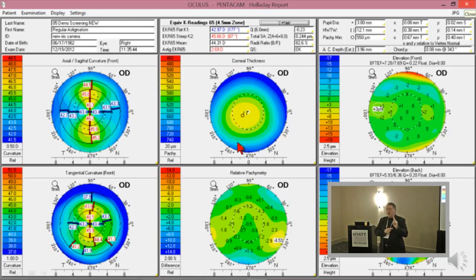Now, it'll turn out the 40 term will be about 0.24. The 60 term will be down in the hundredths, about 0.04. And the 80 term will be down in the hundredths to thousandths. So the last two terms, even though they make it a little bit better statistically, are not a big deal. Even if you only use the 40 term, it's always 10 times bigger than the next term anyway. But what Koch found in that paper is the sum of those three did a better job in predicting the spherical aberration post-operatively than if you just used the 40. So that's why we did it. Okay, is that clear?